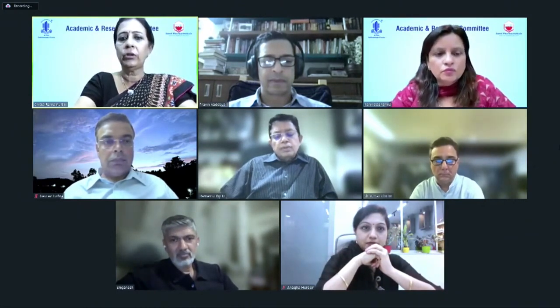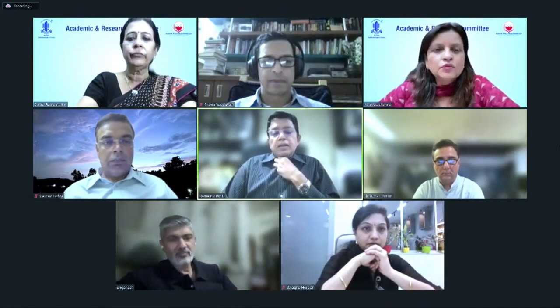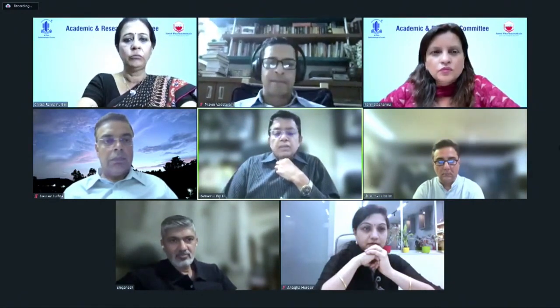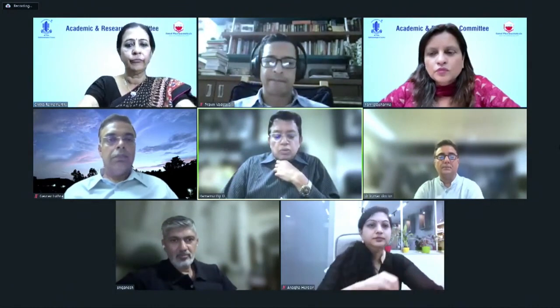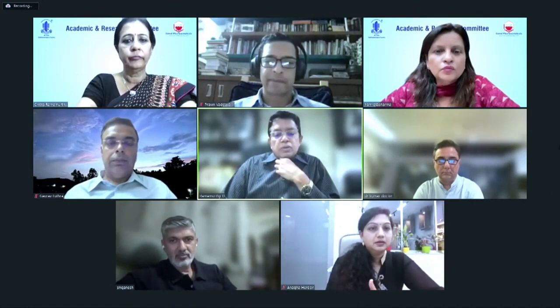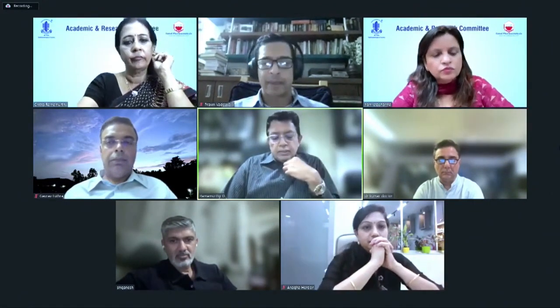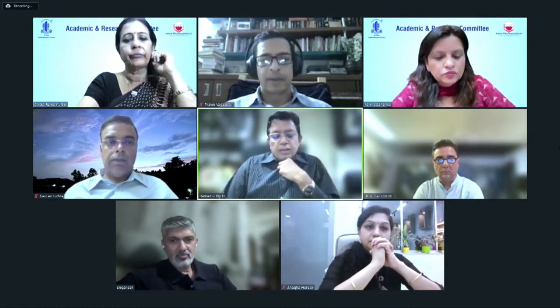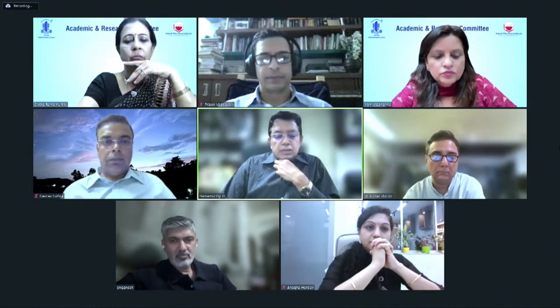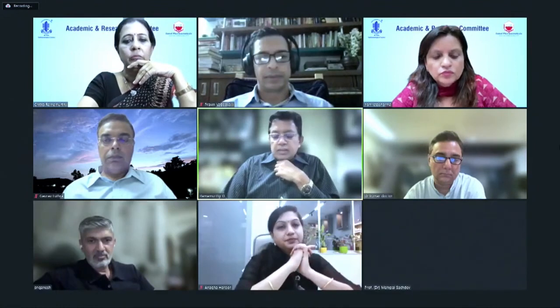Dr. Ramurthy, Gaurav, Dr. Mahika, have you had occasions to do a second wash? It's been extremely rare, more during our microkeratome days, though I don't know whether the microkeratome or the femtoLASIK has any role to play in this. But when it has been recalcitrant and persistent, we have had to do a few cases. The first wash did cause a little subsiding of the interface inflammation, and then in spite of the steroids, when it did not subside, we had to intervene once more, and finally the results were reasonably satisfactory.